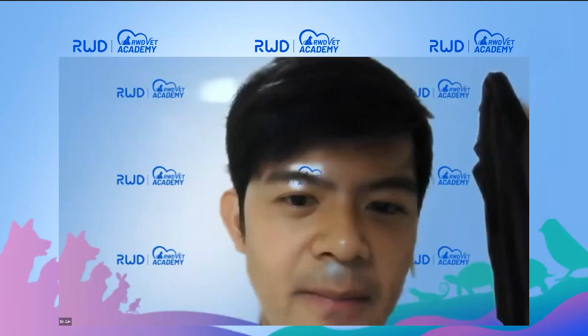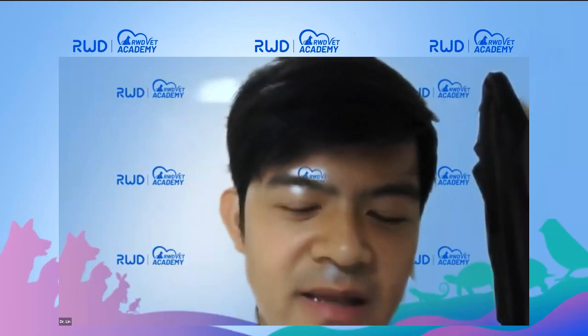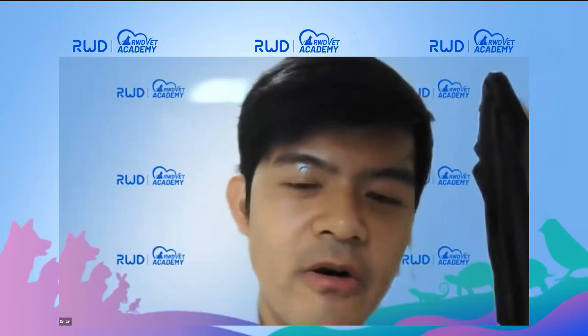The next is, is it possible to recommend that the pet parent rent a laser for the patient and use it at home? My answer is no, because as I mentioned before, laser machines sometimes will overheat. So if the owner uses it at home by himself, maybe side effects will show. So it is better to do the laser therapy in the clinic by a veterinarian.